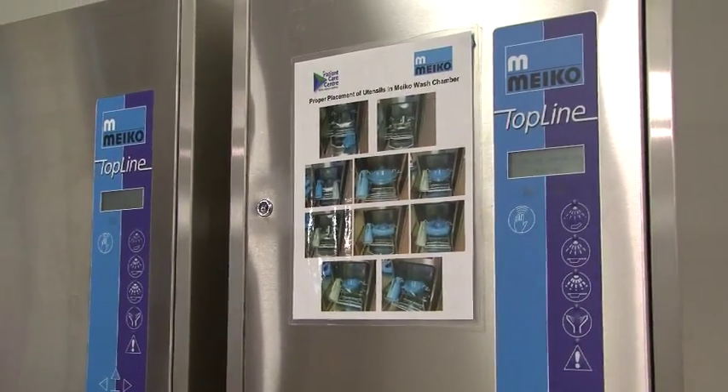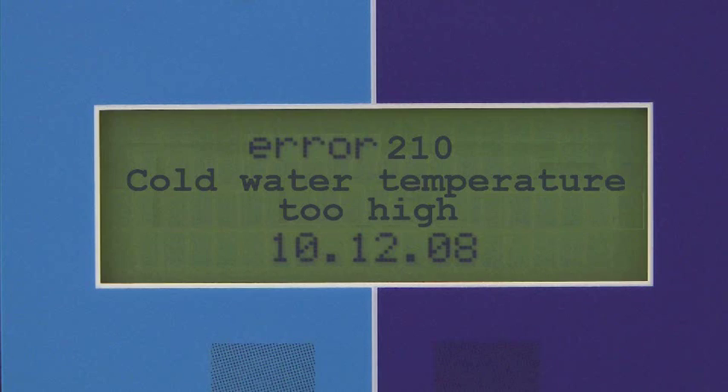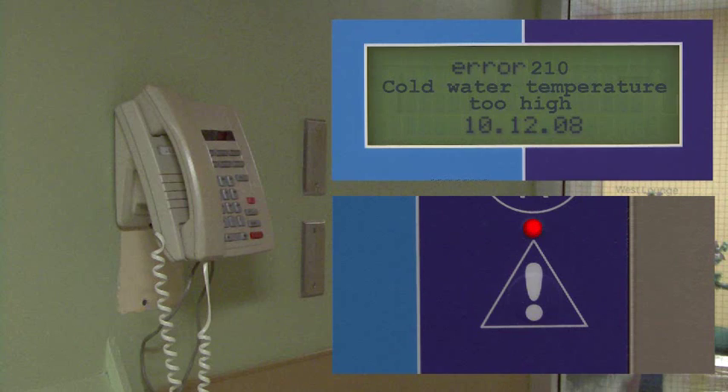If the Myco is not functioning properly, there are additional fail-safe mechanisms that can result in a machine lockout. An error code will appear in the display window and the Myco will shut down completely. If this happens, contact the facility's maintenance office. FMO technicians will attend to read the error codes and diagnose and fix the problem.